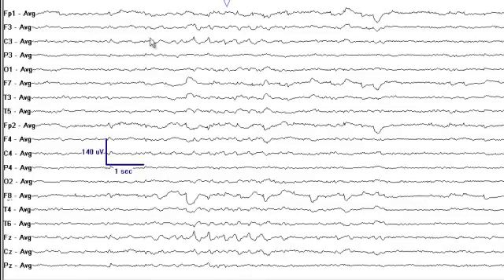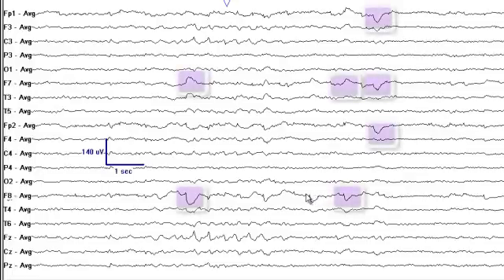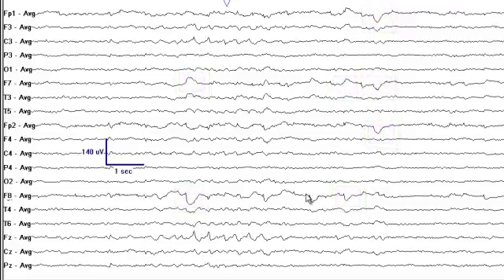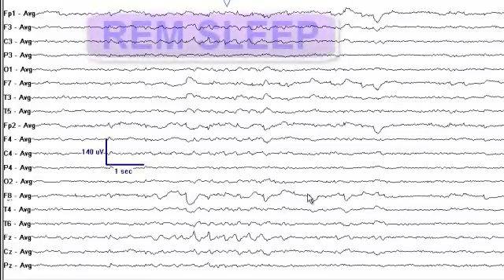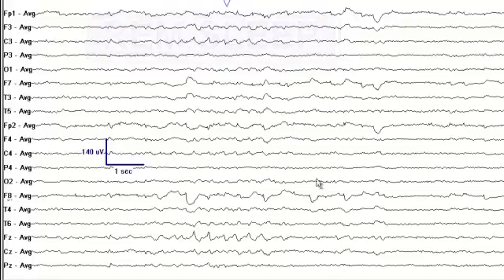An interesting finding is that although the patient is asleep, you notice eye movement artifacts. There is a possibility the patient is in REM sleep. We do not have an electrode on the muscle to record muscle atonia, so we cannot absolutely prove that, but there is a good likelihood this person is in REM sleep at this moment.